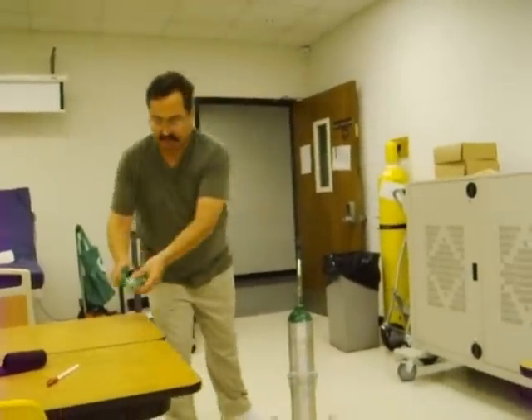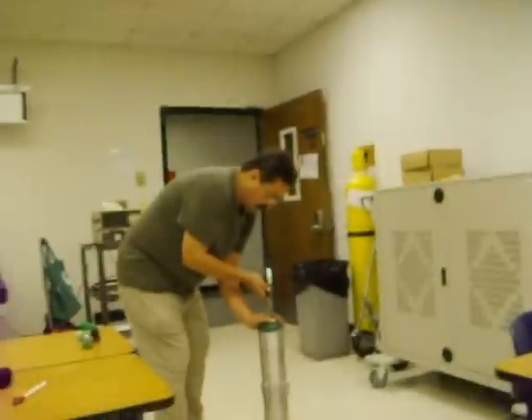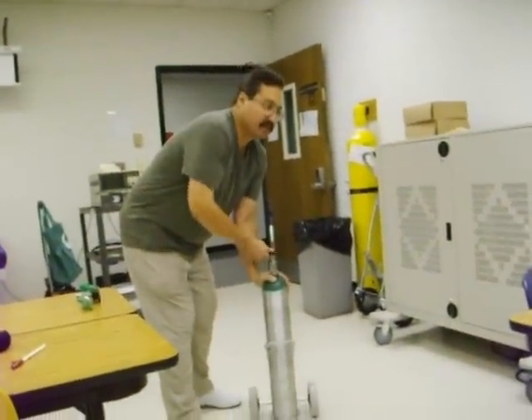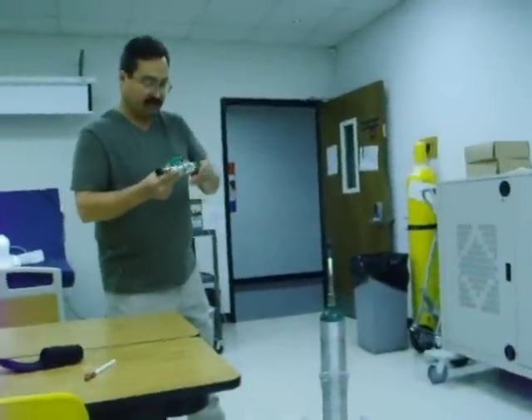The first thing we're going to do, after we've got our equipment together, is crack the tank to remove any debris. Before you do that, I'm going to yell 'crack in the tank,' and the reason for that is so you don't scare your patient in a hospital setting or anybody else around.